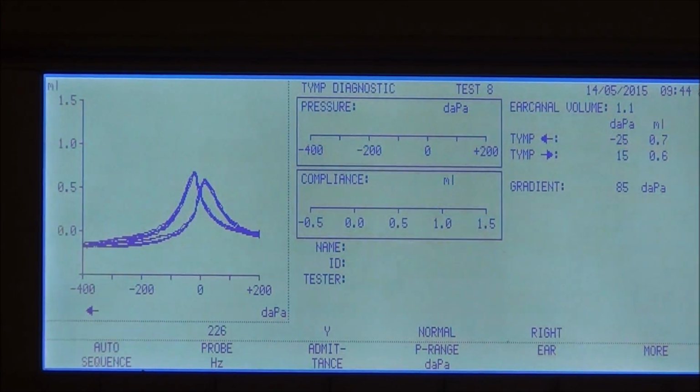actually though you have got different components making out the total tympanogram or total impedance values, measuring some components makes some sense. In this case we are measuring only Y. So why are we measuring only Y? Y is total admittance, right? So we are measuring total admittance by measuring only one component of the 6, whatever constitutes the total impedance reaction.